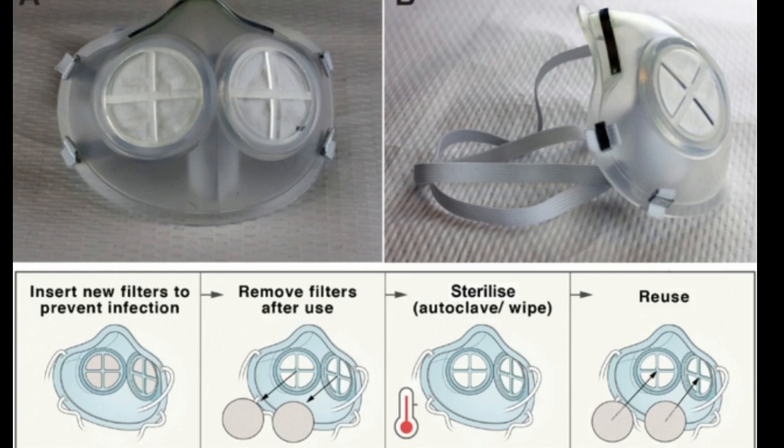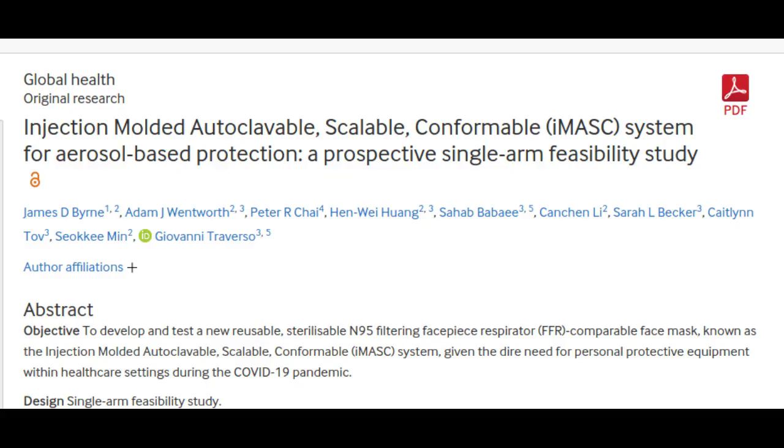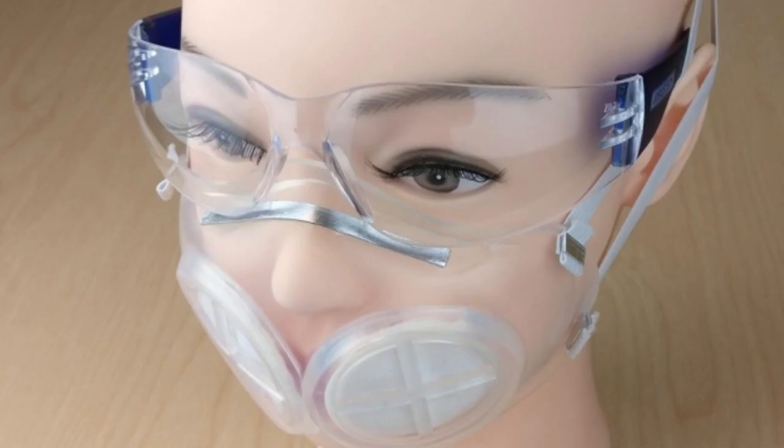The MIT team set out to design a mask that could be safely sterilized and reused many times. They decided on silicone rubber — the material that goes into silicone baking sheets, among other products — because it is so durable. Liquid silicone rubber can be easily molded into any shape using injection molding, a highly automated process that generates products rapidly. The masks are based on the shape of the 3M 1860 style of N95 mask, the type normally used at Brigham and Women's Hospital.